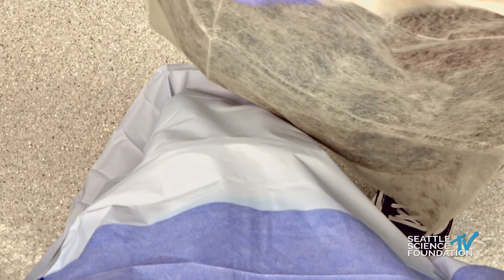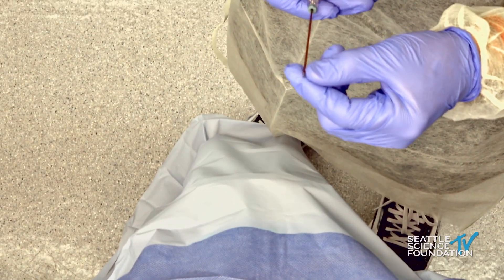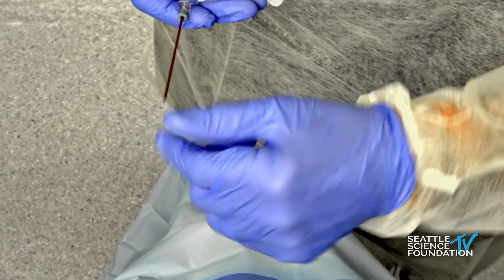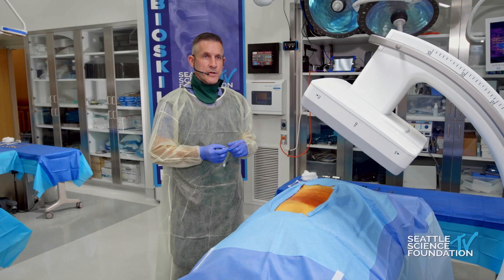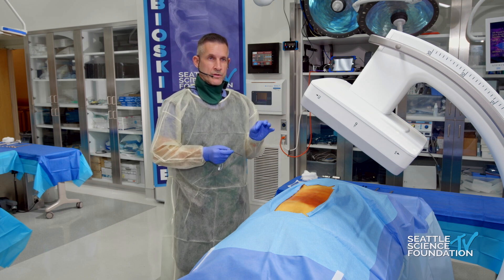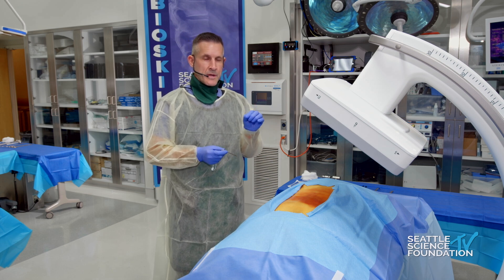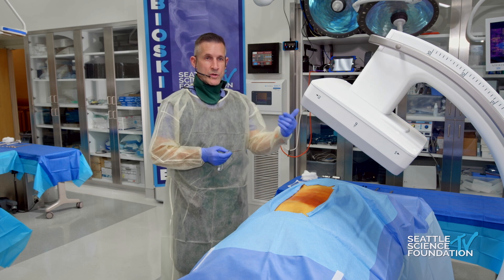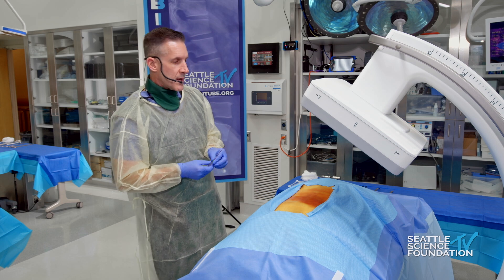It's got angle independence for one thing, but it also projects distally. Because this projects distally beyond the tip, you're able to get about 30 percent beyond the tip, which gives you a larger lesion size. The name of the game in radiofrequency ablation is trying to hit the target you're shooting for — these little small spaghetti noodles called medial branches — but not just hit them, but have an effective radiofrequency neurotomy of them so the patient will get good lasting relief.